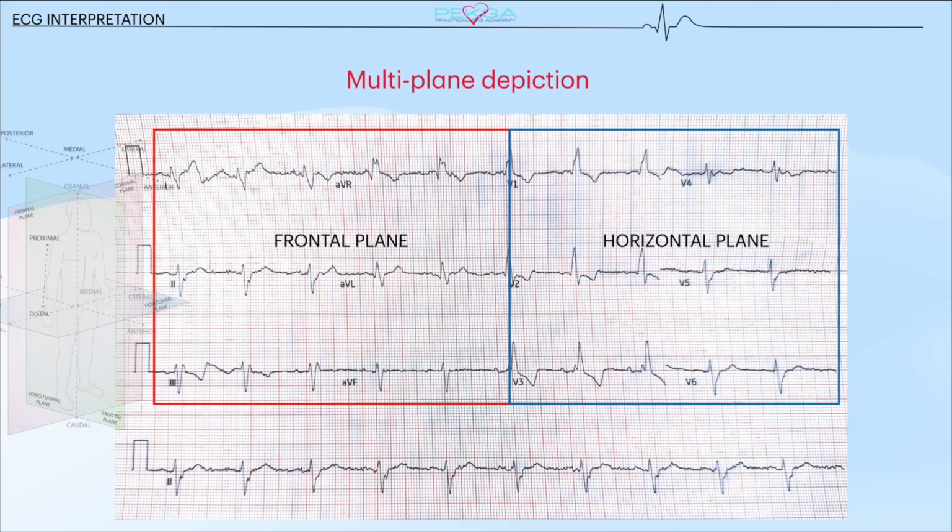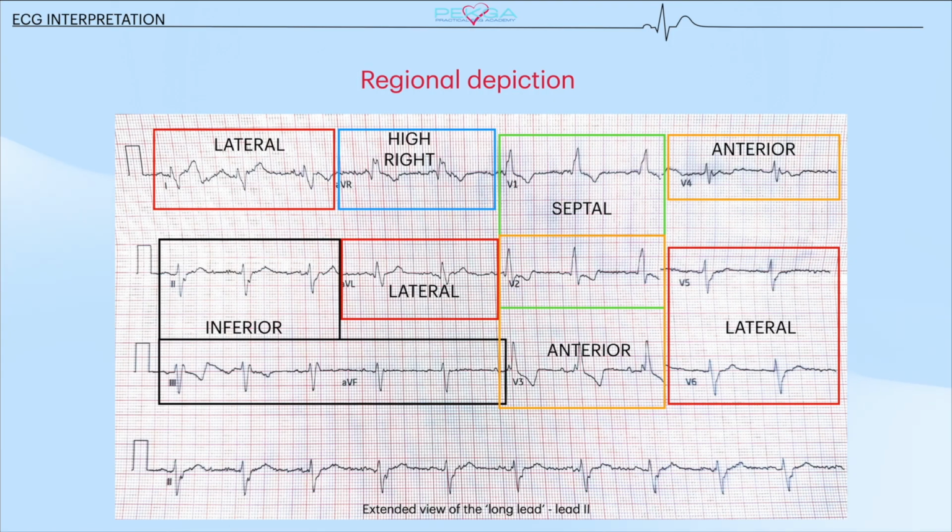That's not possible on some of the lower ECGs. I mean, when you have fewer channels, right? It might be to some extent, but not to the extent that a 12 lead can do. Further than multi-plane analysis, a 12 lead ECG can be broken down into regions.